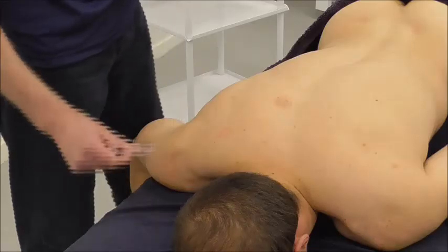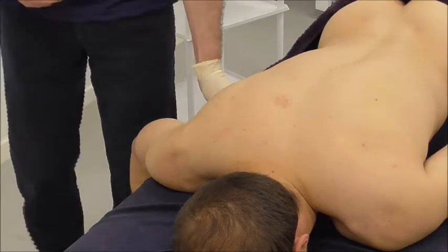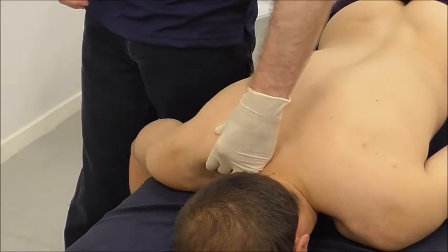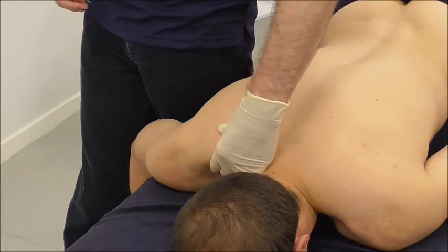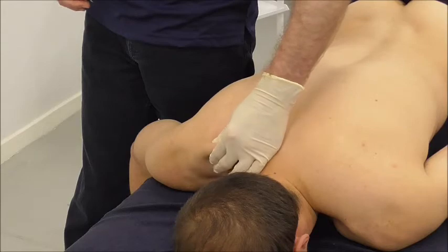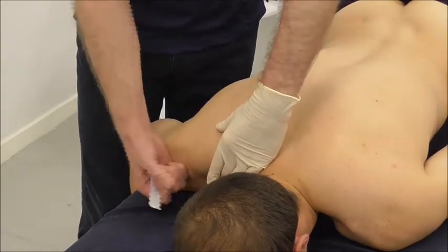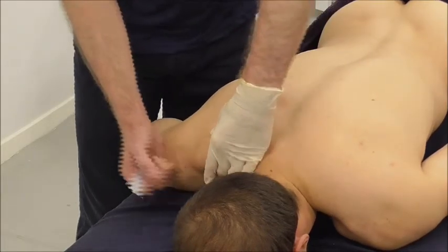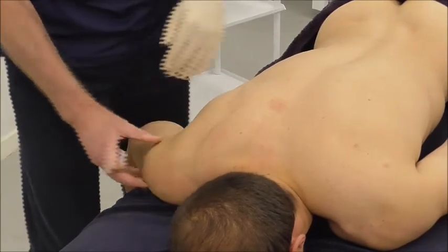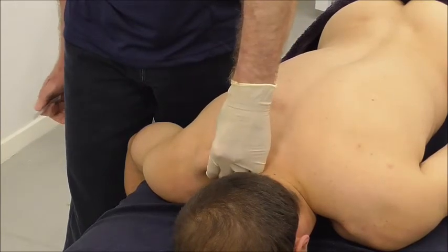Coming to the upper trapezius, we're more or less in the same area but higher up. It's a thicker muscle, so we need to get deeper into it. To do that, I'm going to lift the muscle up — here I'm just lifting a skin fold, but the muscle itself is quite thick. I can lift the arm a little to place the muscle into a more relaxed position, giving me a nice fold of muscle to needle into.